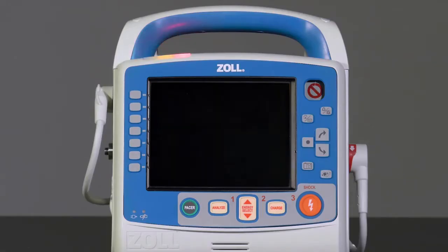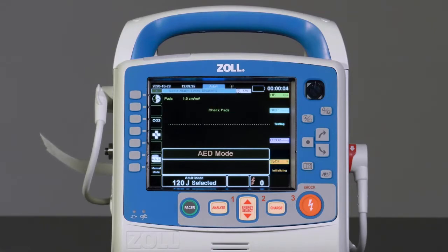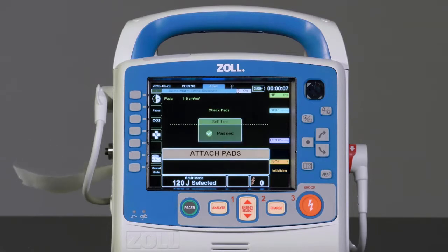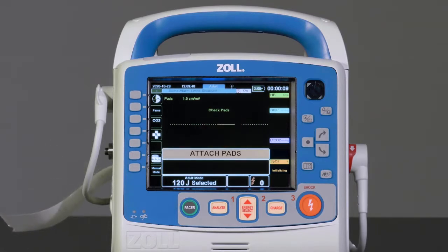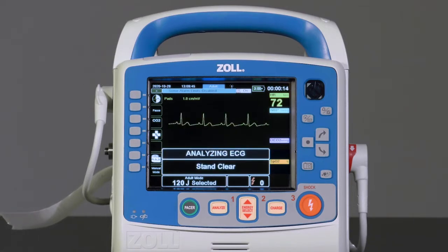Upon startup and after the self-test, the device will display both text and voice prompts stating: Attach Pads. If the patient is in cardiac arrest, apply the electrode pads to prompt the device to enter ECG analysis.